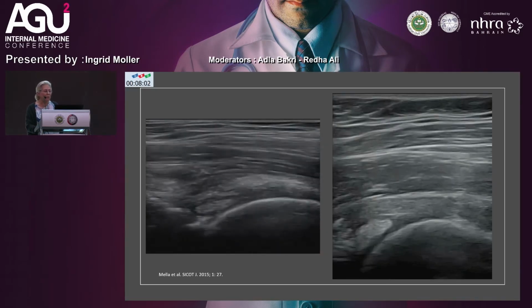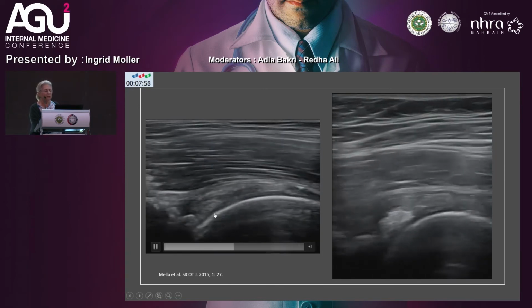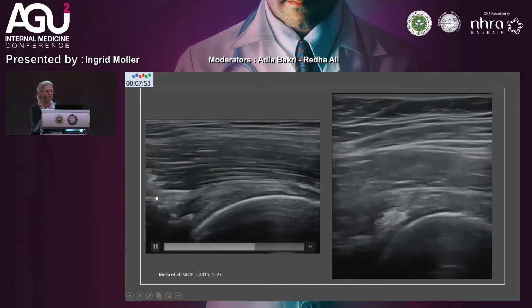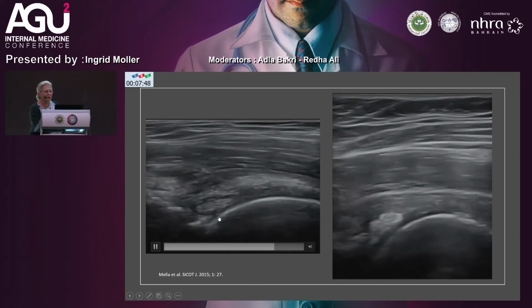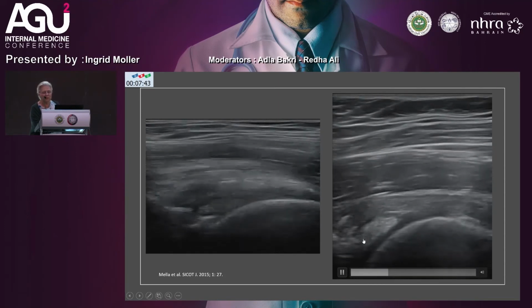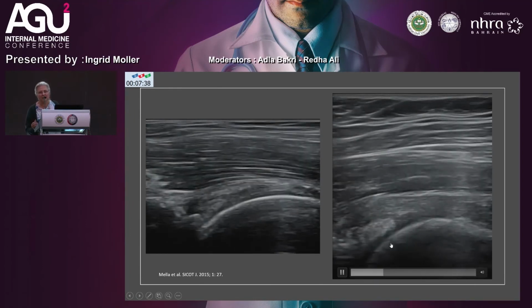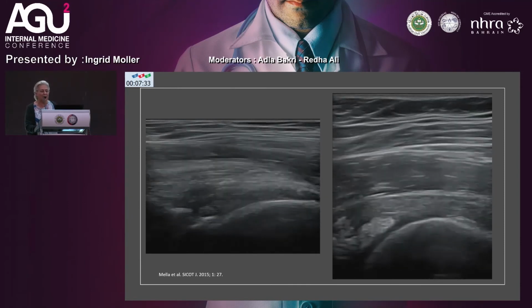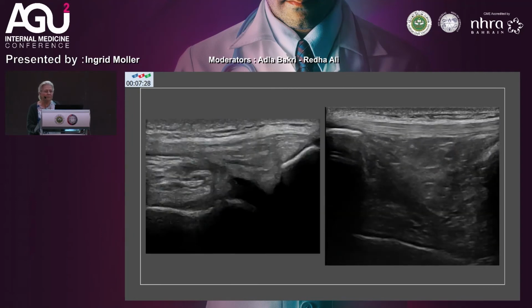And we can see meniscal degeneration not only in the knee joint, but also in the hip joint. And what you see here is acetabulum and femoral head. And this part here, this more hyper-echogenic image that you see on both sides, corresponding to two different patients, is meniscal calcification, that in the case of the hip joint, the name of the meniscus is labrum. So there are labral calcifications in both patients having hip osteoarthritis.